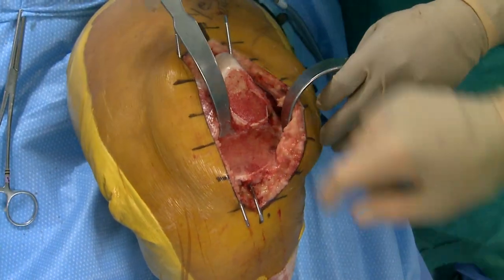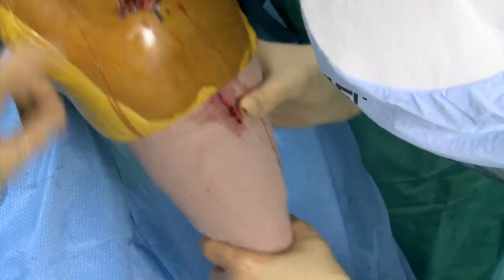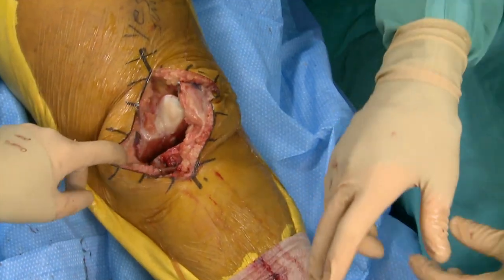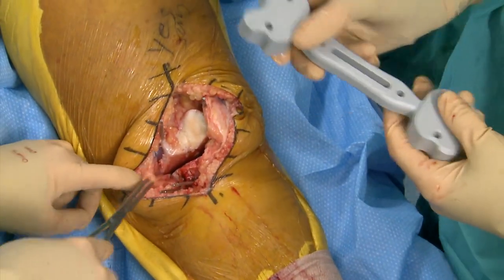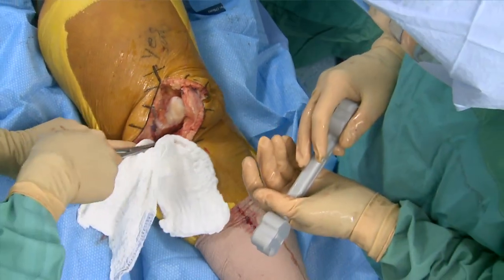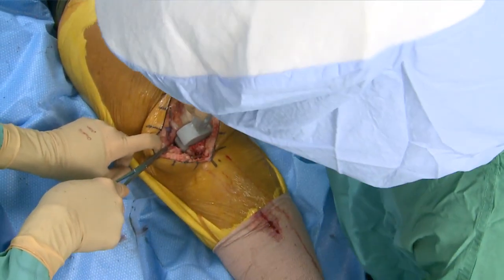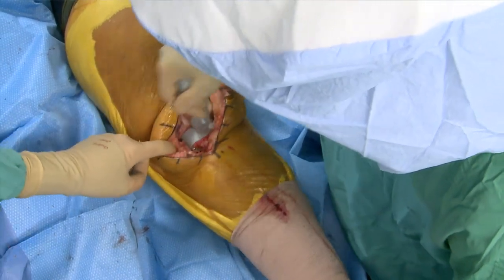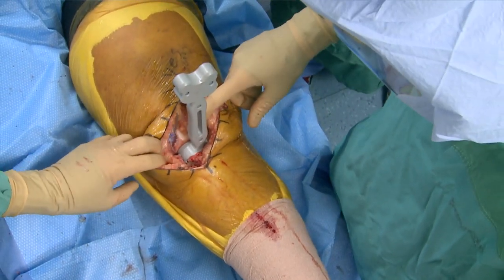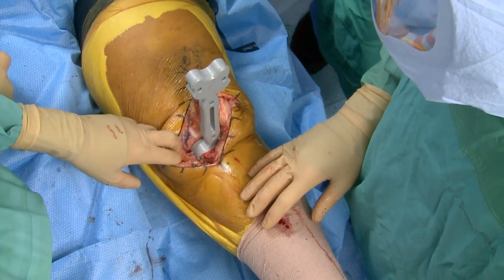We trust the navigation — if the distal femoral cut and the proximal tibia cut are parallel, we have a straight leg. Cuts are 13 and 15. Now we just need to balance. The spacer block went in a little tight and that's in the mid range — I usually shoot for about 10 or 11 because if I shoot for nine and they're tight I don't have anywhere to go. That's a 13.